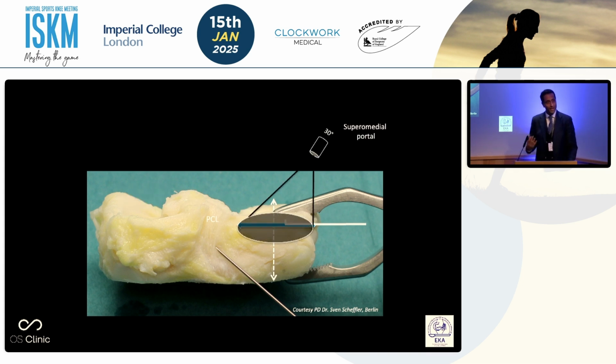And indeed, if you make a second posterior medial portal, which is slightly higher than the one that you're using for your ramp repair, you can also get a really good view.